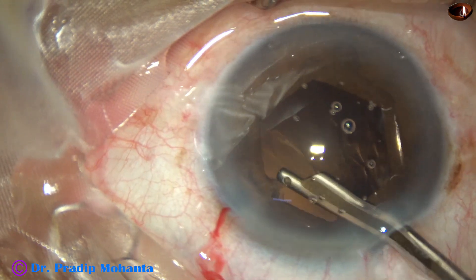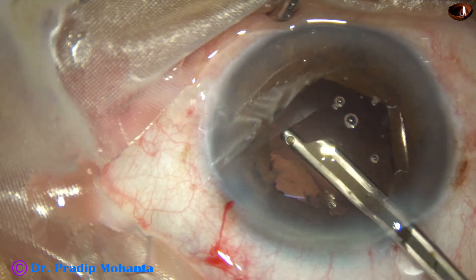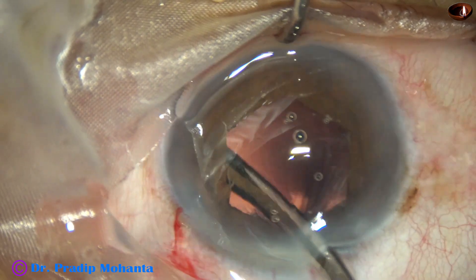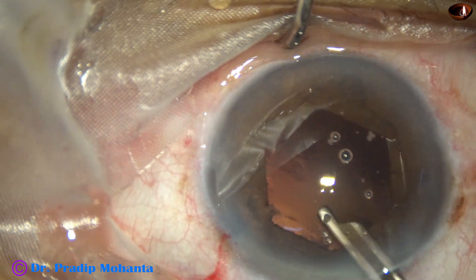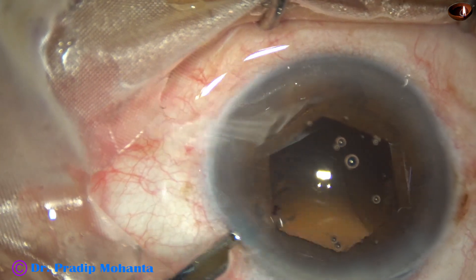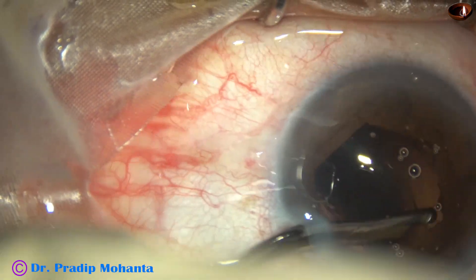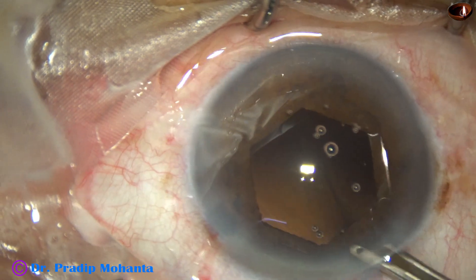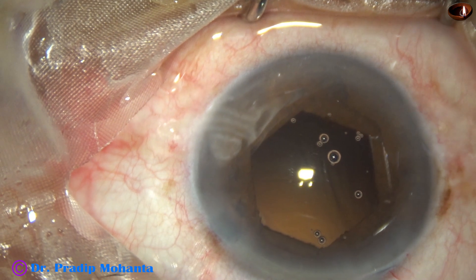Now I am removing the cortex. I can't see the cortex directly, but with a sweeping motion I can catch it and remove it. A 23-gauge Simcoe passes easily through the 1.6-millimeter side port, and with only one side port we can manage this case. Even B-hex application didn't require another side port — with the main wound we tucked two flanges, and with the side port the remaining flange.